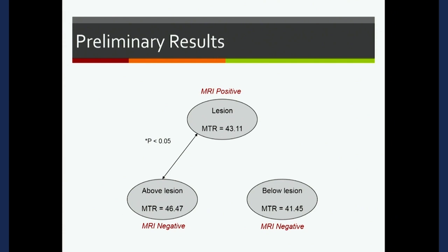Next, lesion versus below lesion. Do you think there should be differences in MTR values when we look at MRI positive lesion versus MRI negative below lesion? Right? Yes? No differences.